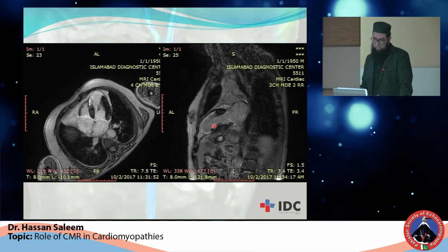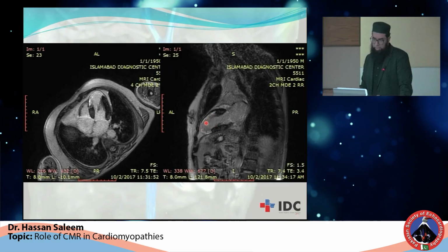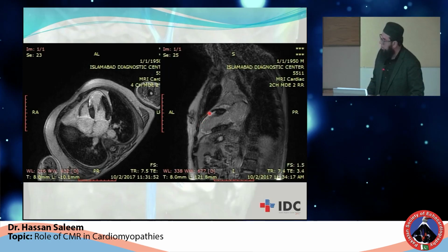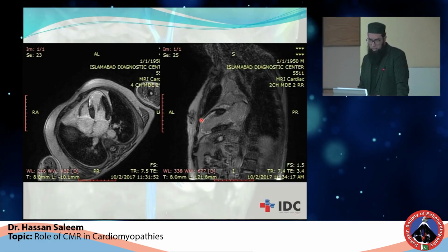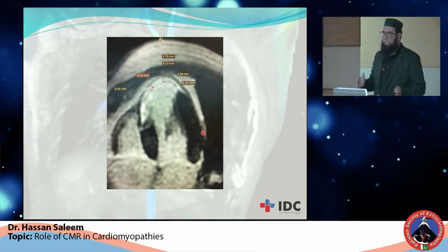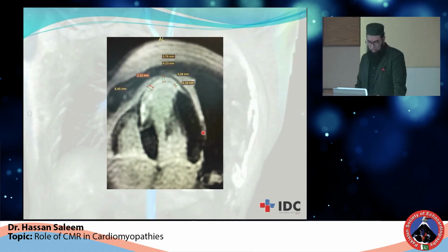Similar patient that we were looking at in the cine images. The anterior wall, as you can see, is infarcted. There is some black strip, if you can appreciate on this image. This is a normal myocardium that is spared. So this is a viable myocardium there, but the apex is non-viable. Depending upon the thickness, you can easily measure. It's very reproducible, not a very big problem.